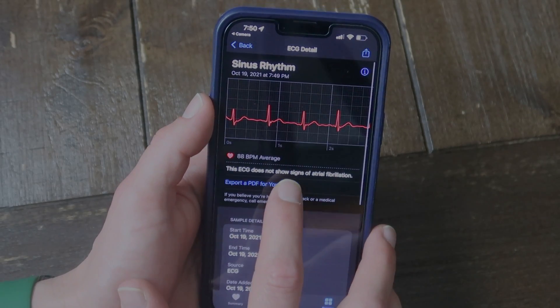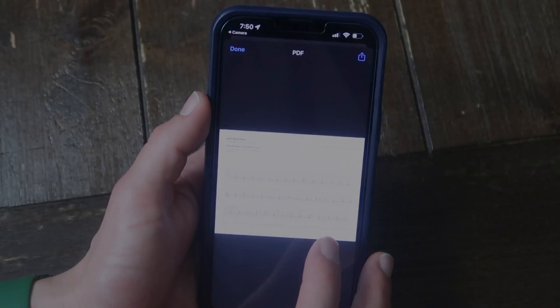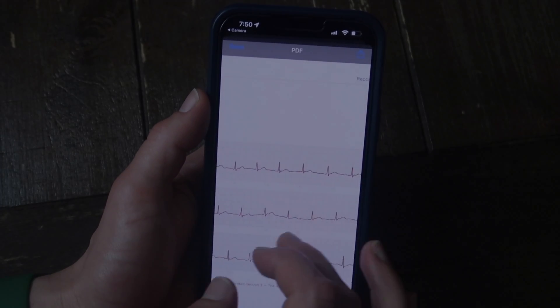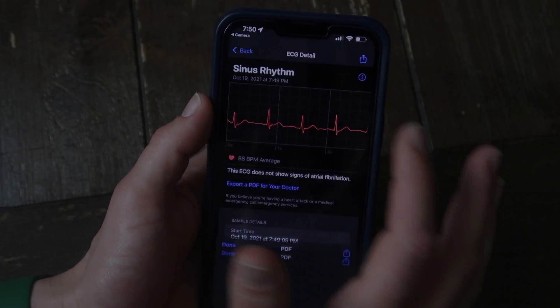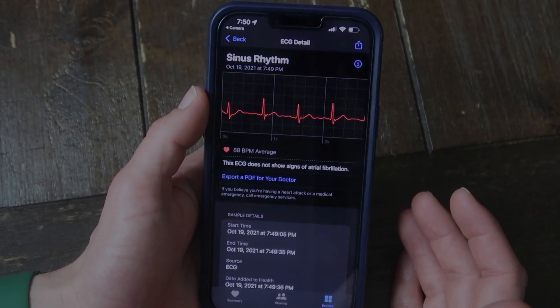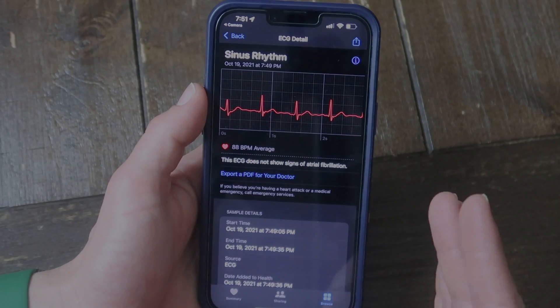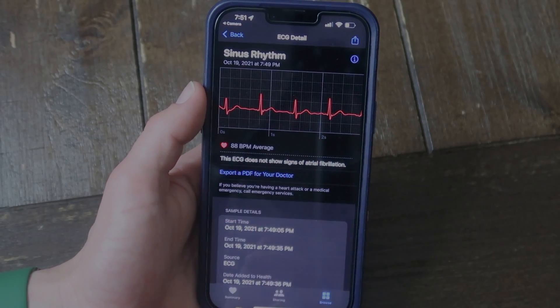What's really cool is you can actually go and export a PDF to your doctor. So it takes a PDF giving you all of the information, all of the readings, and you can send that to your doctor. So if your doctor is monitoring you for a heart condition, this will save you the time of having to go to the doctor, the expense, and they can just look at this, which is super awesome.